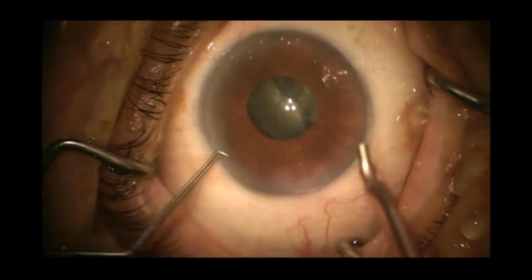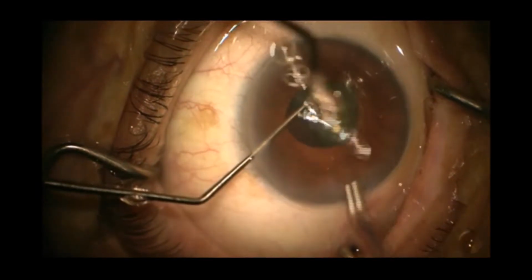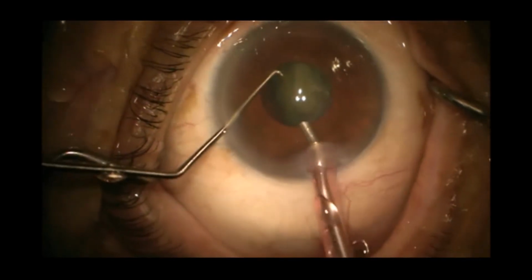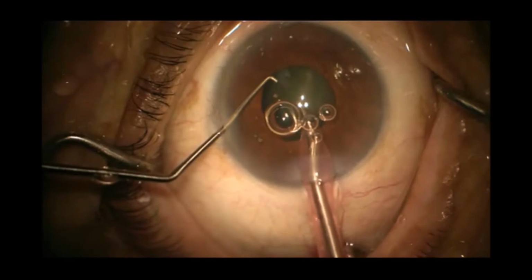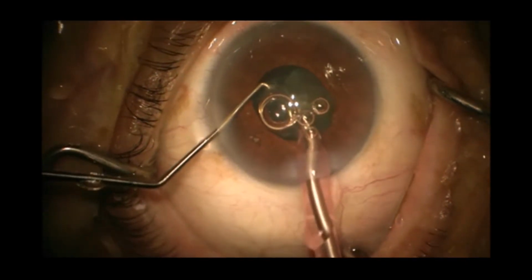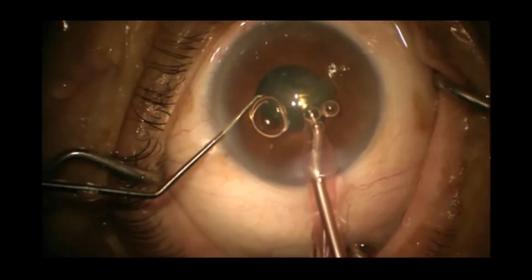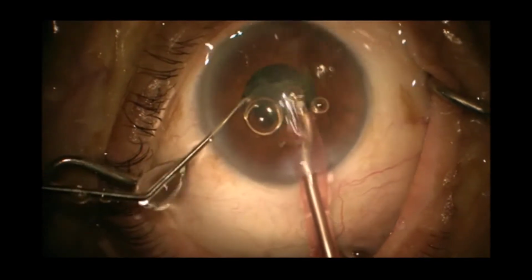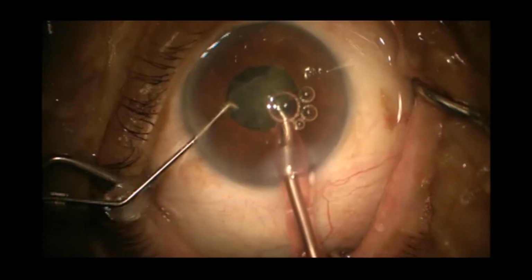Now with a Sinskey I go behind and support this epinuclear bowl and the plan is to feed this last piece into the phaco tip directly. So I impale the phaco tip directly into the lens matter, and with again lower parameters, low vacuum and flow rate, emulsify. This is a fairly soft cataract, grade 2.